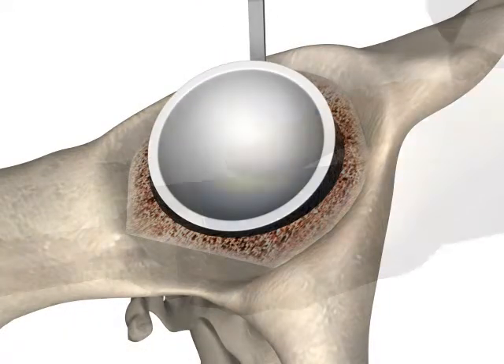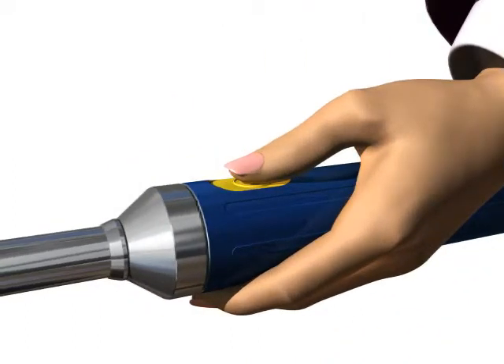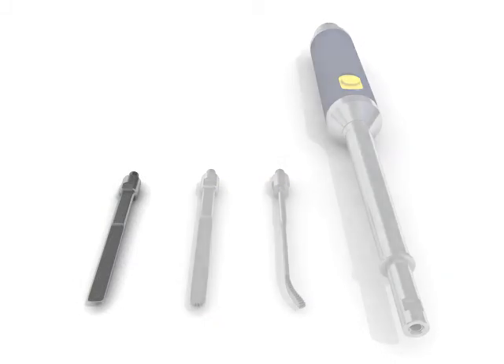It is important to remember to activate the probe before advancing into a previously created slot, and to not apply manual pressure before activating the probe. Doing so may lead to the probe improperly tuning and possibly breaking during use.